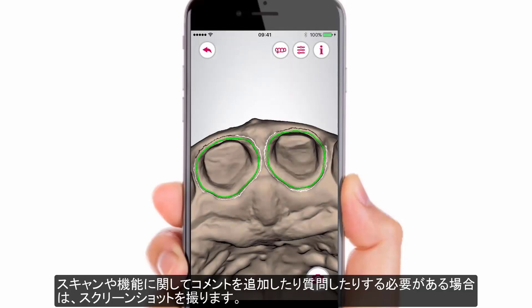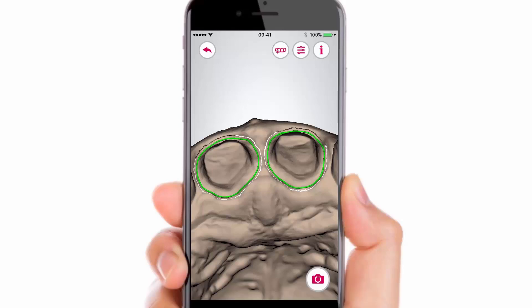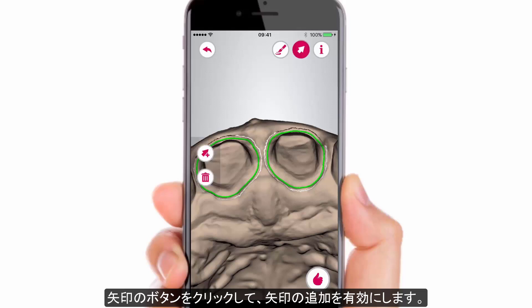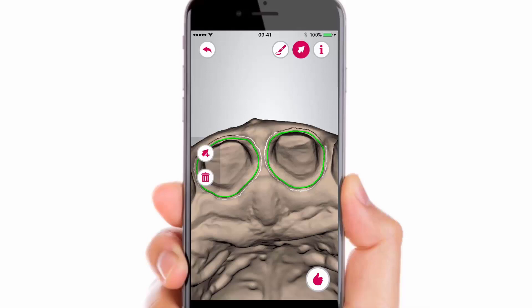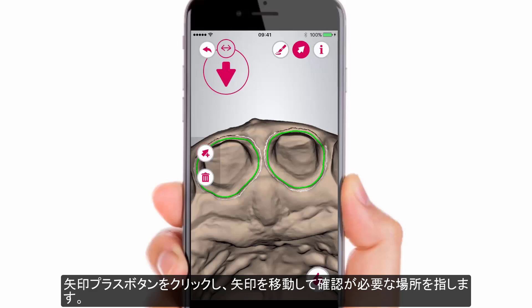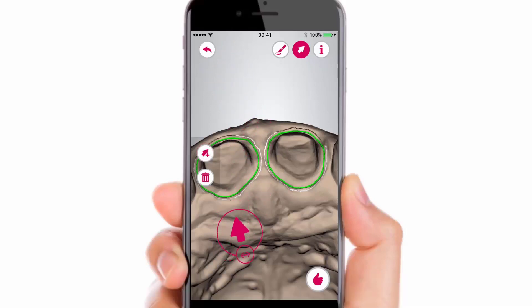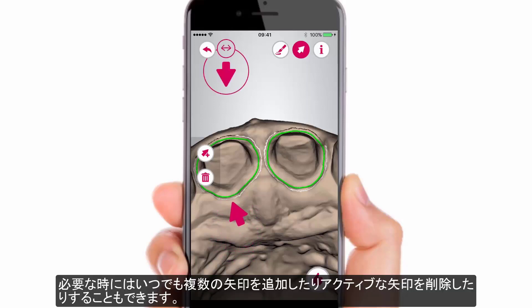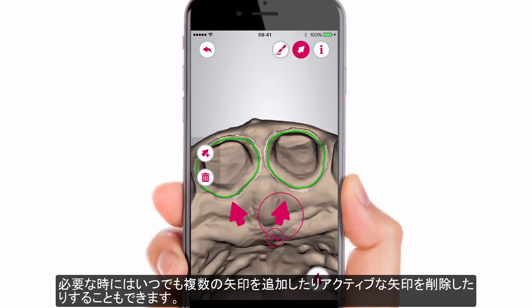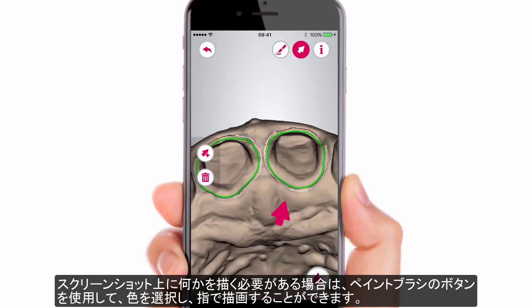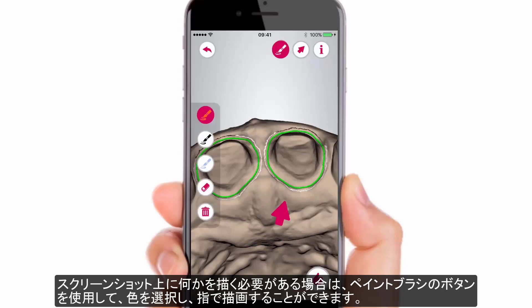If you need to add a comment or ask a question in relation to scans and features, take a screenshot. This will move you to the edit screen. Click on the arrow button to enable arrow adding, then click the arrow plus button and move the arrow to point to a place that requires attention. Adding multiple arrows is possible, and you can always remove an arrow that is active at any given moment. If it is necessary to draw something on the screenshot, use the paintbrush button.